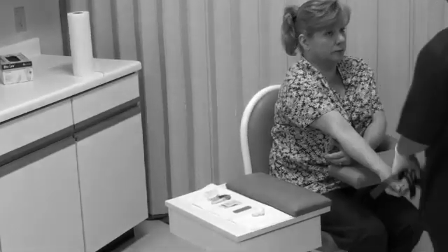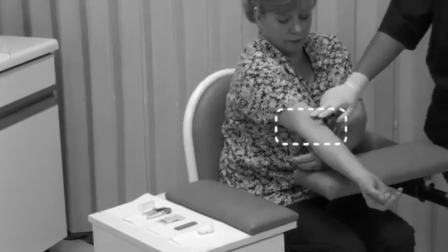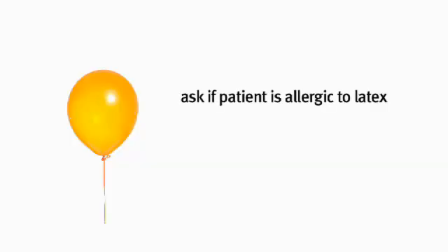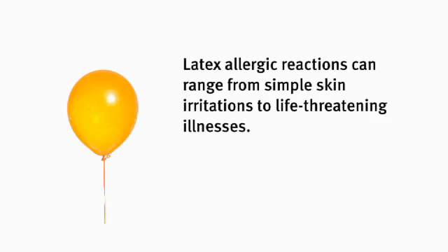This area right here is the antecubital region. This is the area we're going to be obtaining the specimen from. First, I'm going to ask my patient, Mr. Reed: do you have a latex allergy? Always ask, because it can create problems.